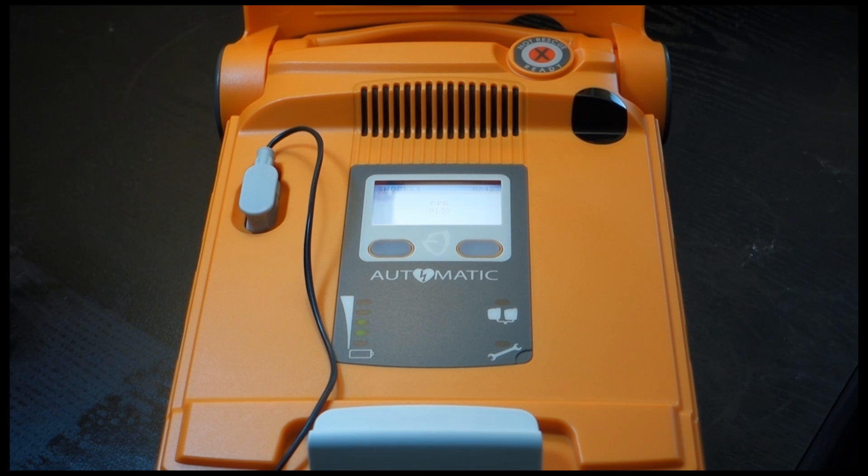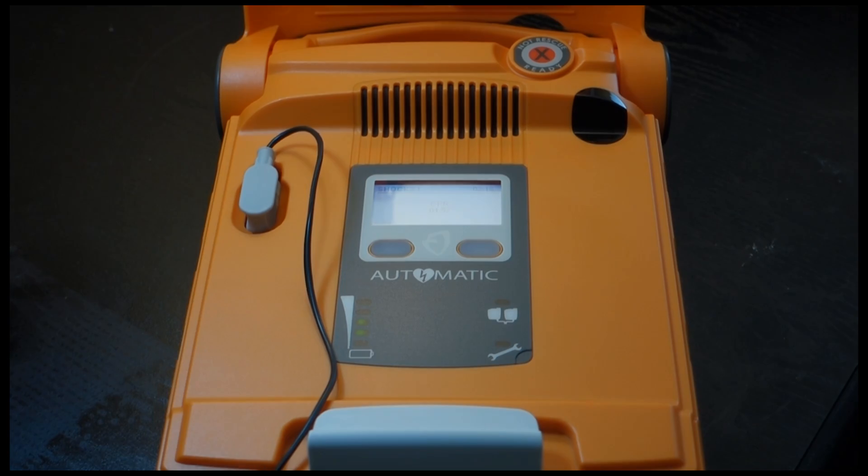Press, press, press, press, press, press, press, press, press, press, press, press, press, press, press, press, press, press, press, press, press, press, press, press, press, press, press, press, press, press.